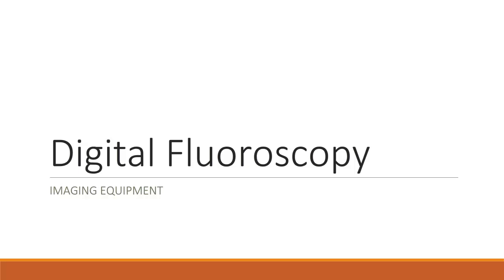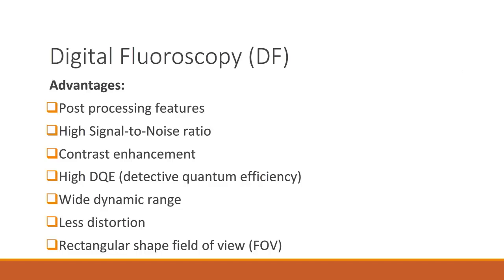Digital fluoroscopy is similar to conventional fluoroscopy in looks, but there are some differences that you should be aware of as a radiographer. This video will review those differences and other basic concepts related to digital fluoroscopic equipment. There are many advantages of digital fluoroscopy over conventional fluoroscopy, starting with post-processing capabilities.